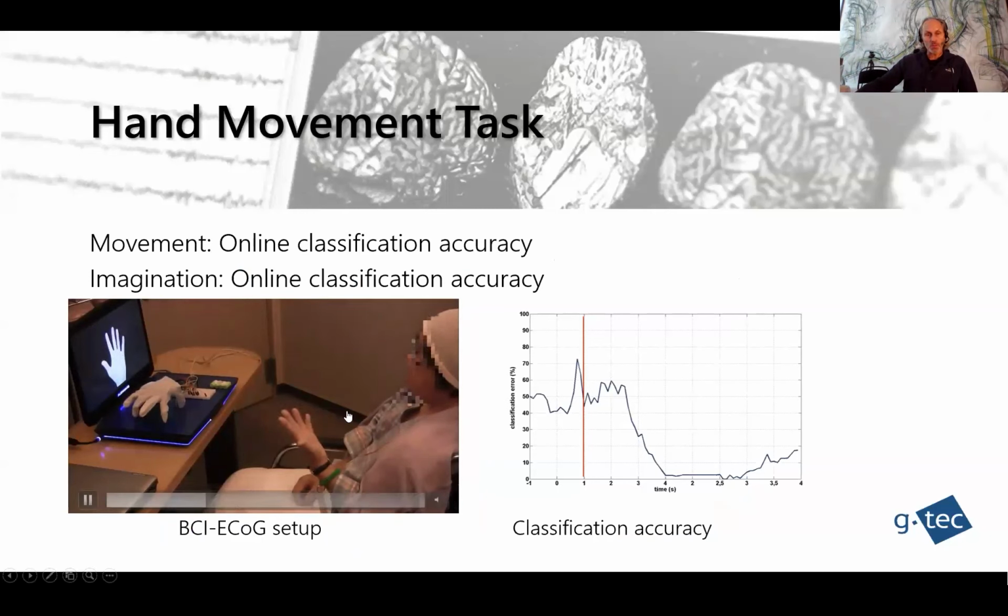Now she's making the peace sign. Also the robotic hand makes the peace sign. We can even decode the ECoG faster than the robotic hand is reacting. So you can see there are no false positives. The robotic hand is doing exactly what she is doing. There's one very interesting moment at second 28. You have to watch careful.